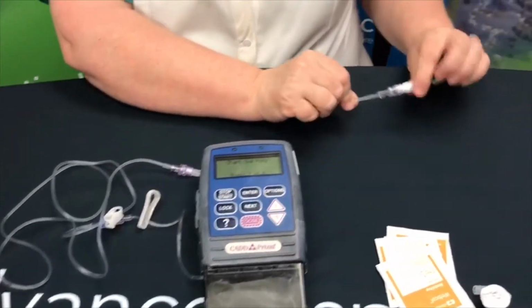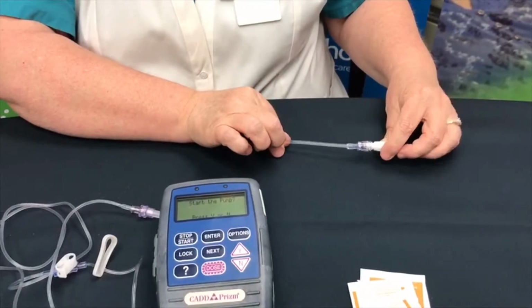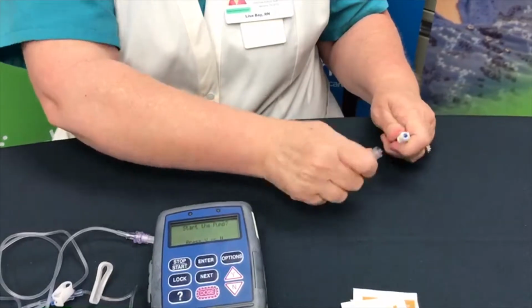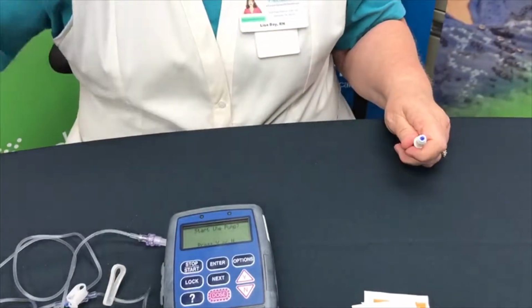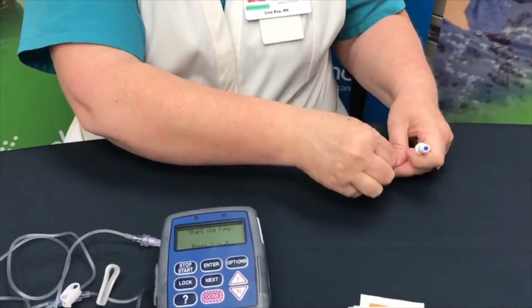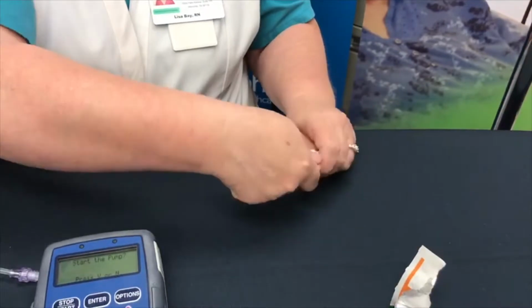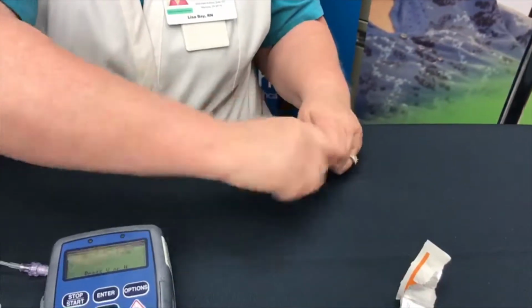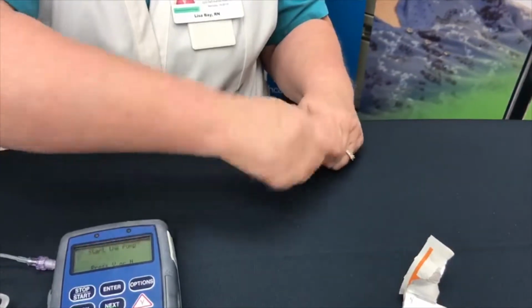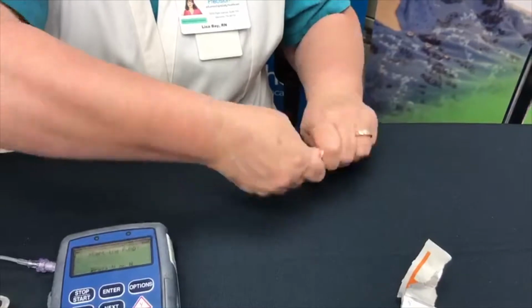So here's our IV line with our current pain pump attached. We're going to disconnect our current pain pump. We've already turned that pump off. We want to make sure to clean the end of our IV line before we attach the new tubing. So we're going to clean all around the sides and in the center, 10 to 15 seconds, using a scrubbing motion.